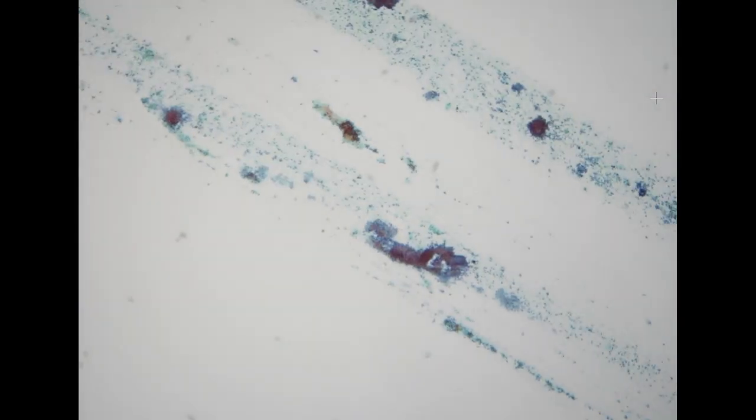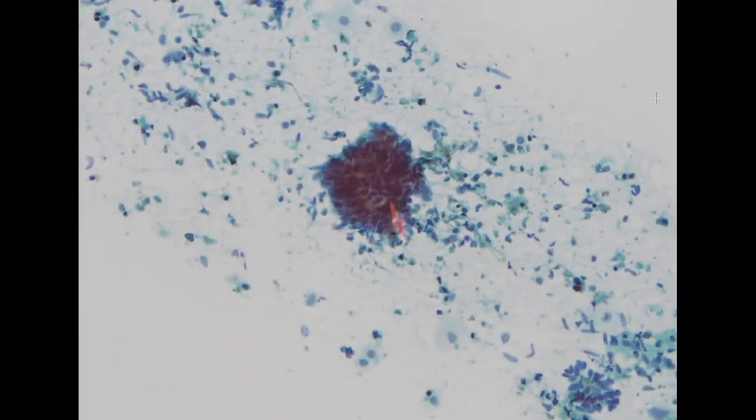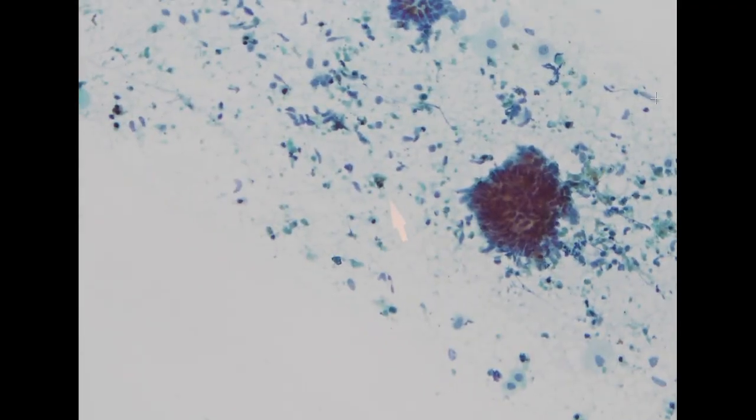So let's move to some fine needle aspiration. The first one is coming from a lung nodule. On low power, you can already tell that the background is quite dirty, and you see a lot of cellular debris in the background.